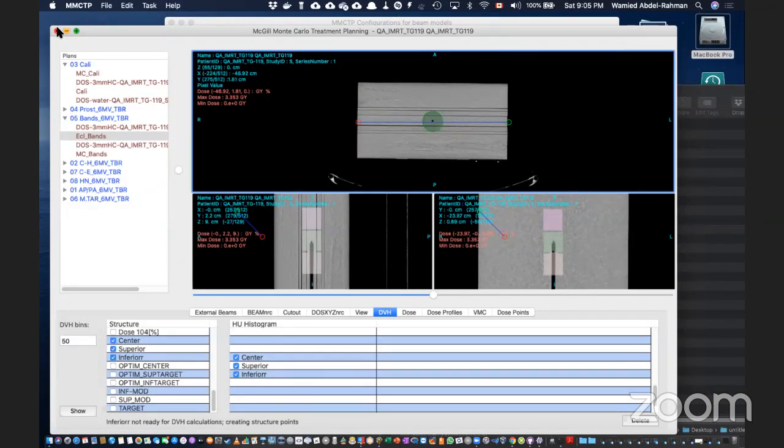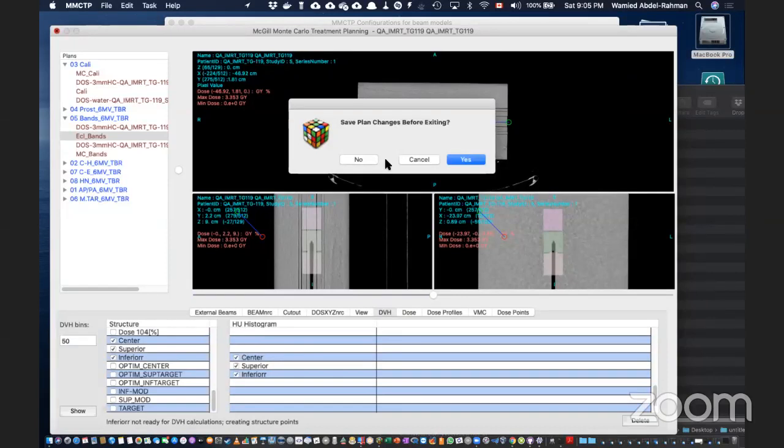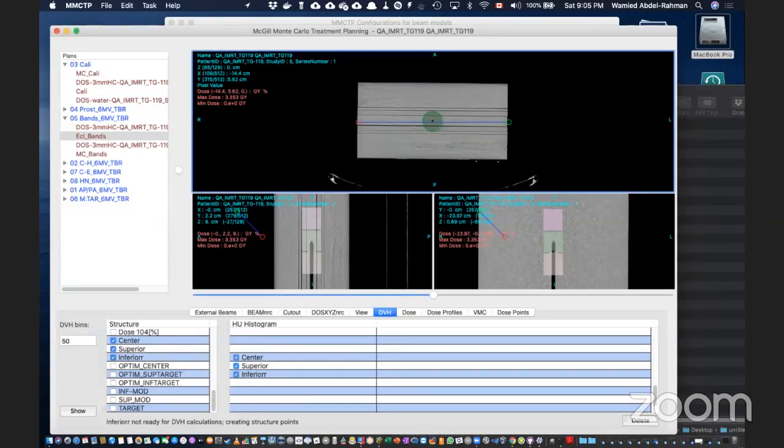Thank you, Dr. Omid. Yeah, there are bugs. For a viewer, for RT DICOM, if there is an extra viewer for it other than this program.